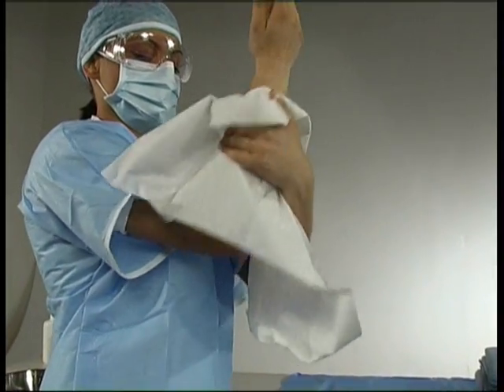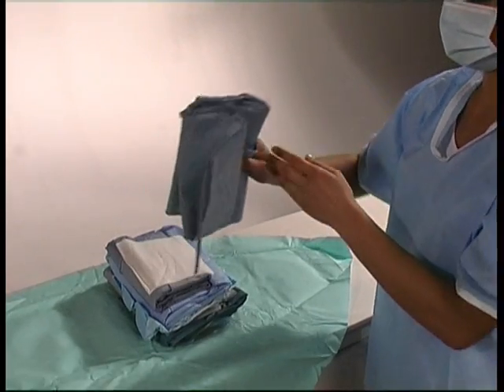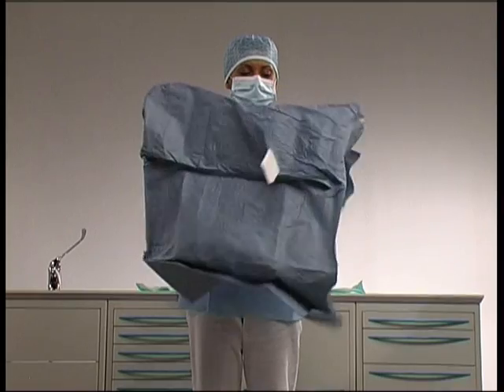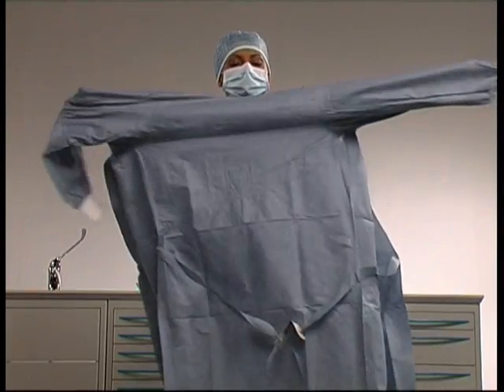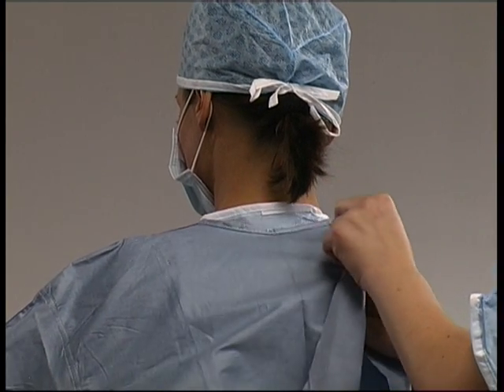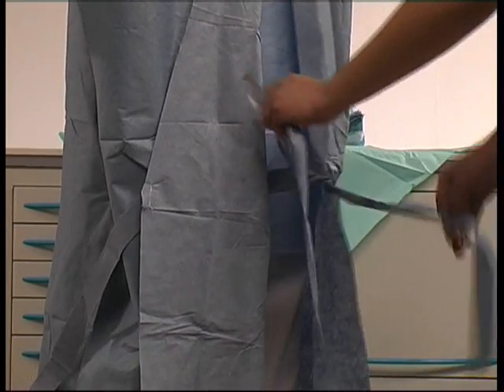The washed assistant takes a sterile towel and dries herself. With the help of the non-sterile assistant, she starts to dress. First, she takes the surgically folded gown from the packet. She puts her hands into the armholes, taking care not to touch the outside of the gown. She slides arms into the gown, keeping her hands inside the cuffs. The non-sterile assistant fixes the gown, at the top with the Velcro and at the waist using the internal ties.